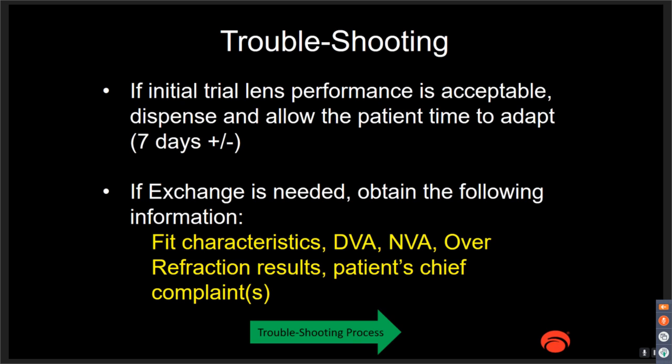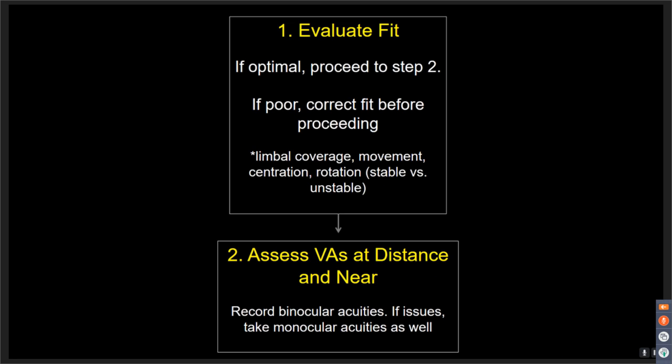Listen to what the patient's chief complaint is. There's a difference between a patient that says, I work on a computer, and the patient that spends 8 to 12 hours on three screens all day long. So you have to analyze what it is that your patient is doing all day long, analyze their complaints, and then explain to them what can be modified to improve their result.